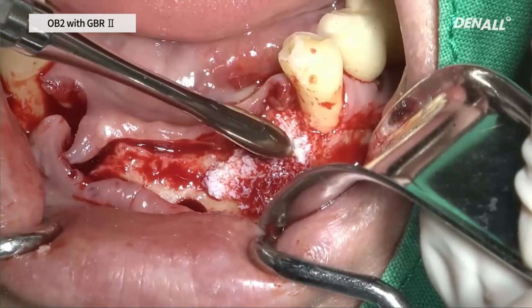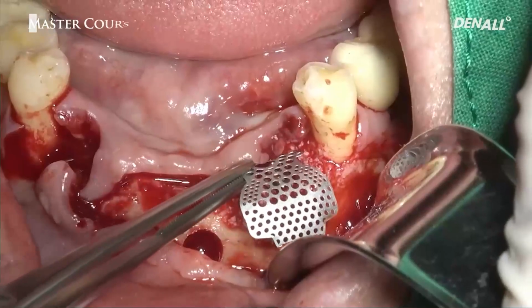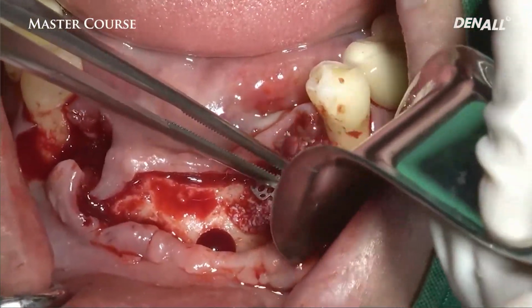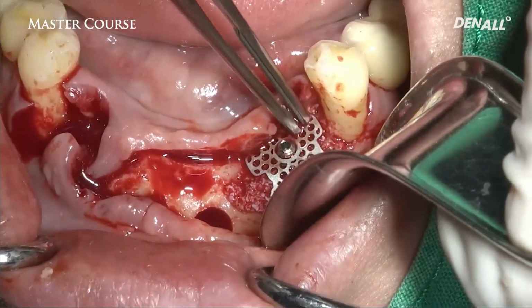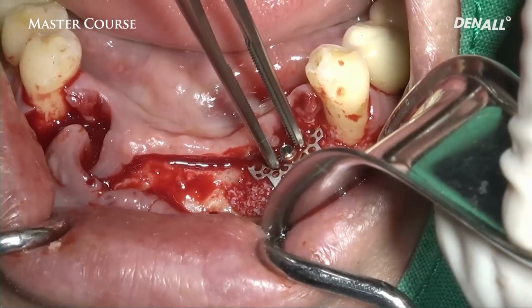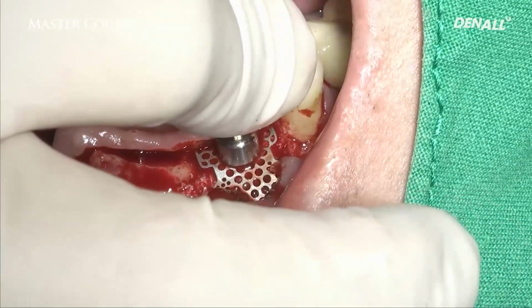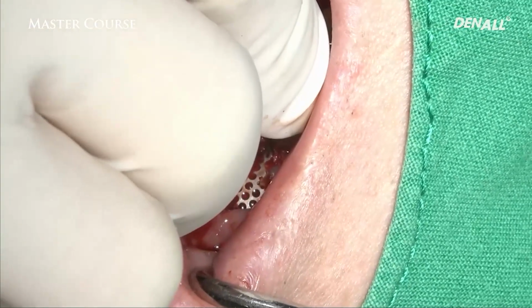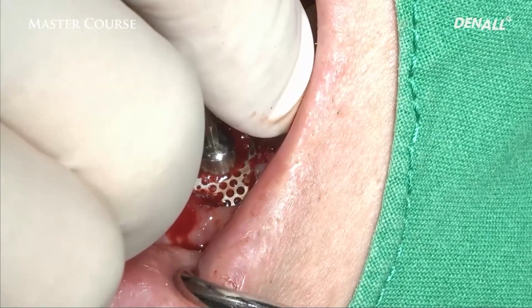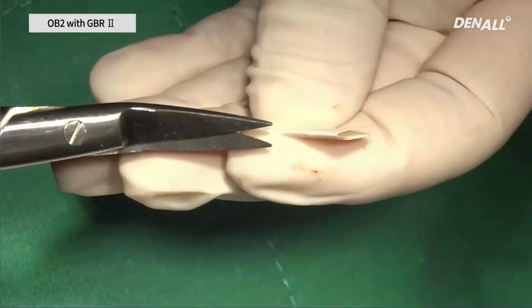On the left side, sandwich technique was done for bone graft. The defect form encompasses the buccal and proximal area. I chose 2-wall augmentation type Ossbuilder so that proximal area can be covered with the proximal wing. I used a 5mm healing cap to fixate the Ossbuilder on the implant. GBR was done a transmucosal way.